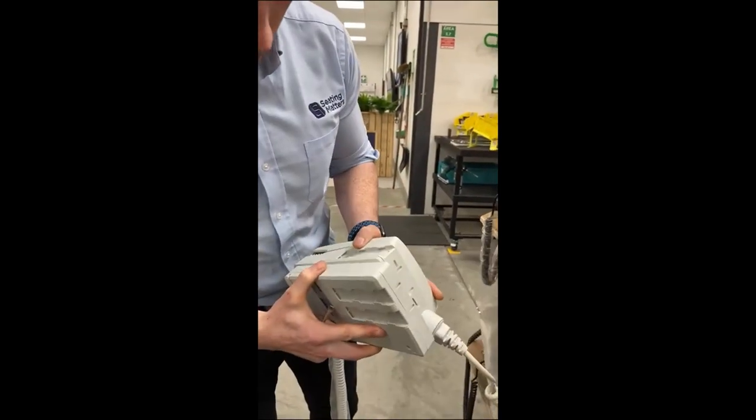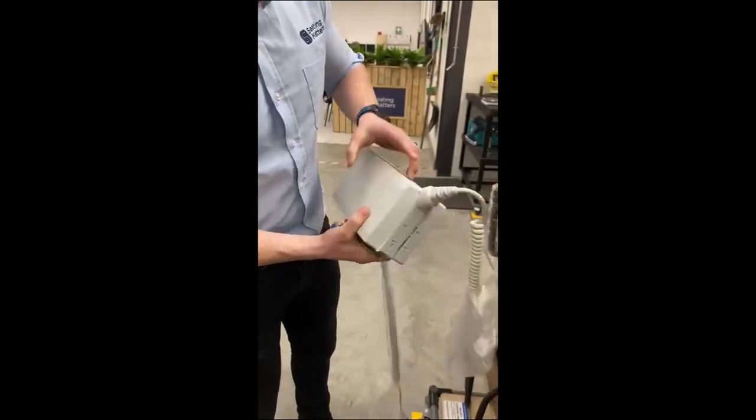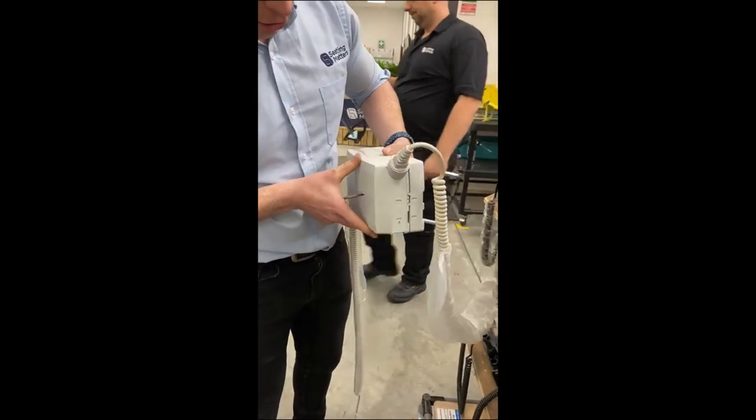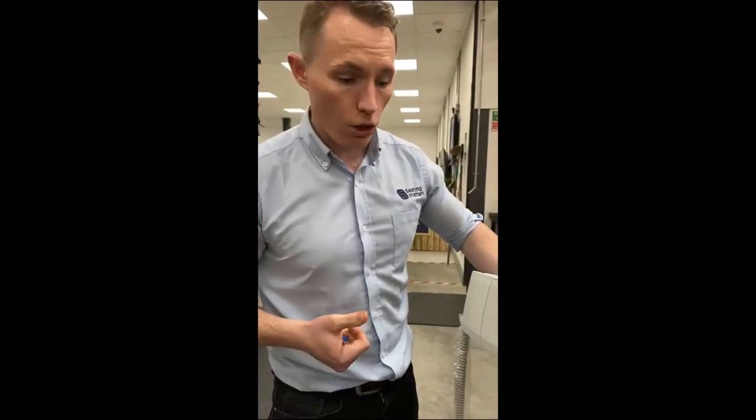Just reverse how it goes on — clip it back on, and then when you get it on to the chair, you just clip it on and move it across. Thank you.